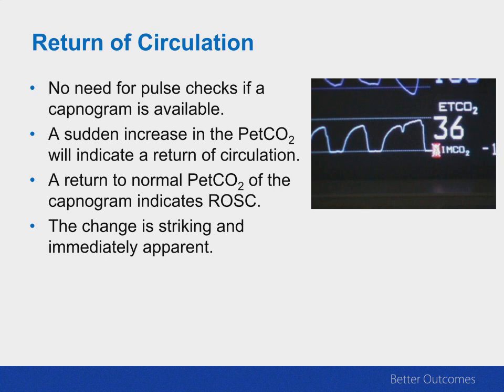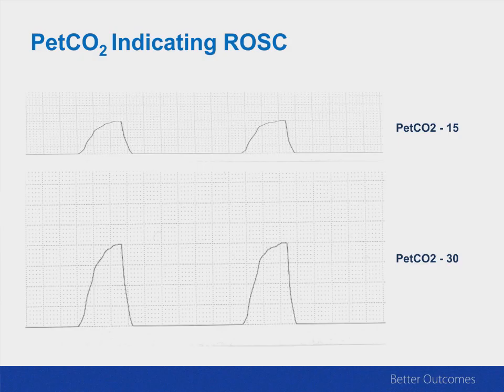Just watch your capnogram. If the person has a return of circulation, you'll see an immediate jump in the end tidal CO2 level. I've seen this many, many times, and I'll give you an example. This would be an illustration during a code where we had an end tidal reading of about 15. And when the person had a return of circulation, we didn't even do anything.